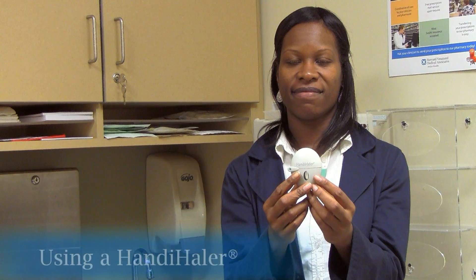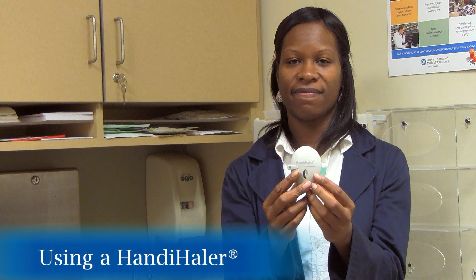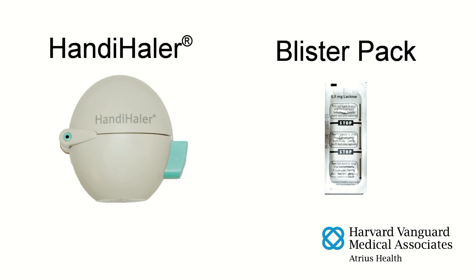This is called a handihaler. It is a device that delivers a dry powder medication used to treat COPD. The medication is contained in capsules that come in blister packs and are used with the handihaler. The capsules should only be taken out of the blister when you are ready for your dose. Do not swallow the capsule — it must only be used by inhaling it with the handihaler. We will now demonstrate how to use a handihaler.